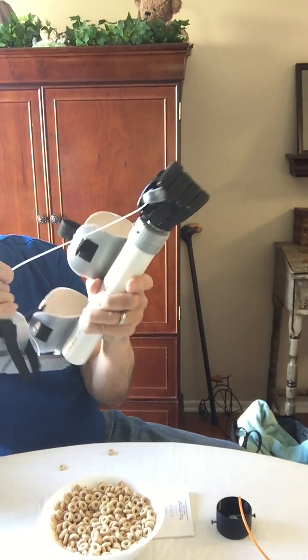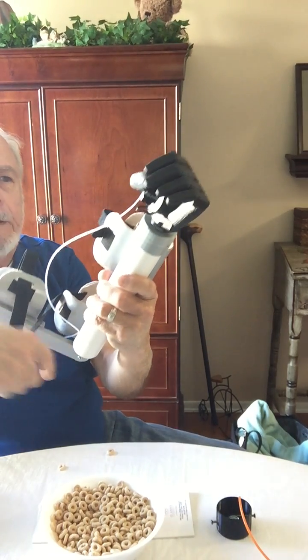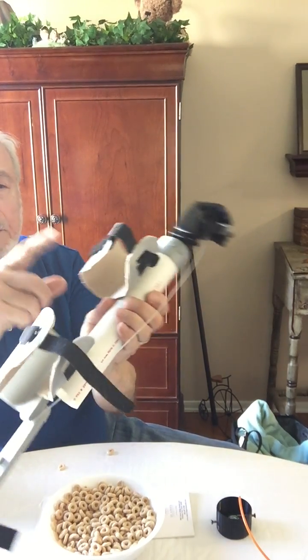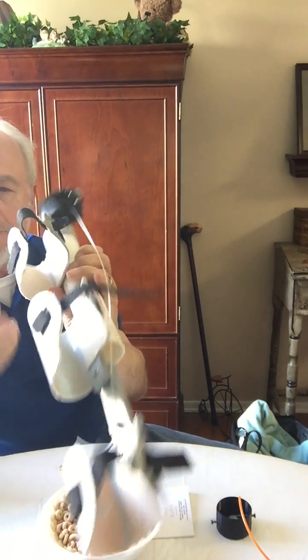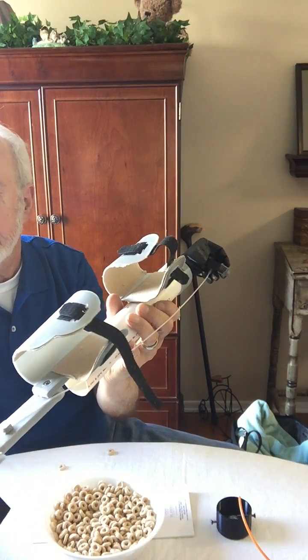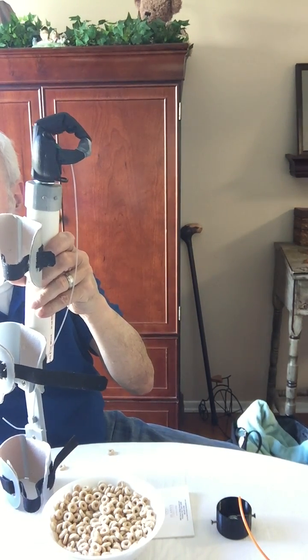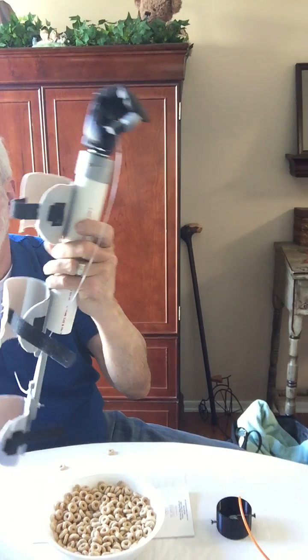And whoops, I find that I have to readjust my Bowden cable because the distance from the elbow to the attachment point here is not right. So that's easy to do with this design. And basically, to make these cuffs, we print them flat, use PLA, dip it in hot water, and after 15 seconds, you can pull it out. If you're careful, you can let them sit on the table and form them into this kind of taco shell shape. And that's easy enough to do without any special rigs and so forth.